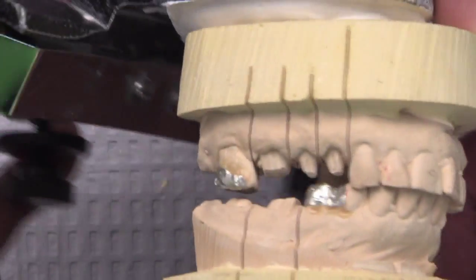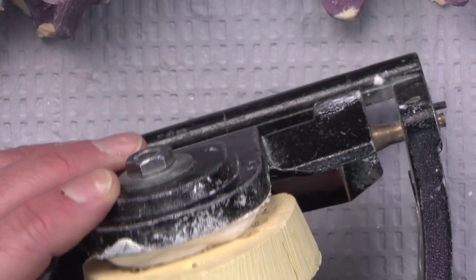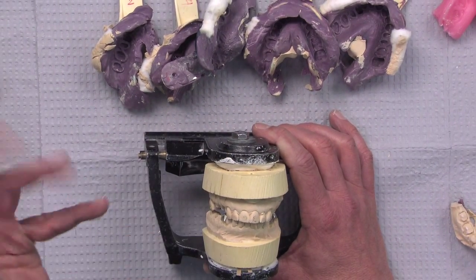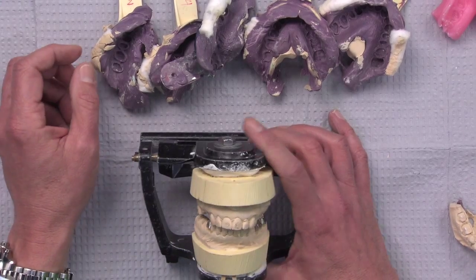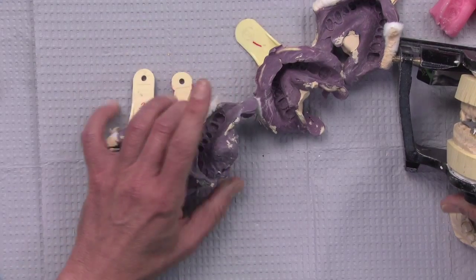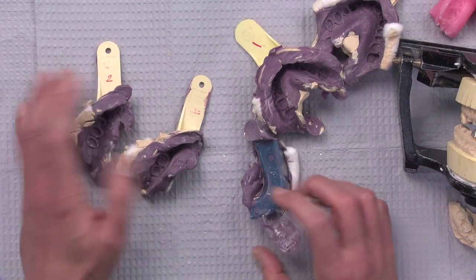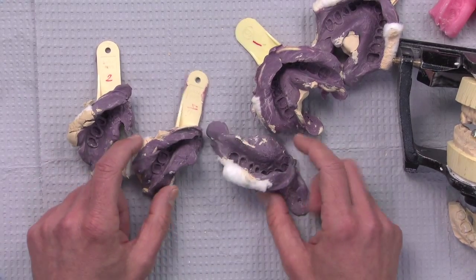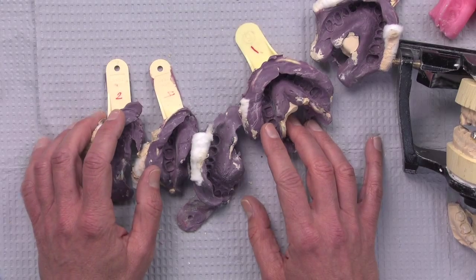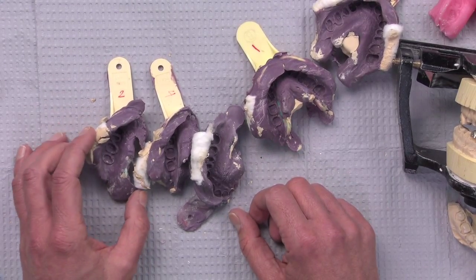So great job done on the occlusal reduction there, and considering that's the number one problem that we see in the laboratory, it's really nice to see a doctor prep 8 teeth and have enough reduction on all of them. So if anything, as I look back at this case, we're going to need a couple more new impressions to get started here so we can clearly see the margin. To me, this comes down more to the impressions themselves. The preps, the occlusal reduction, nothing wrong with those. Those are all going to work when we can see the margins.